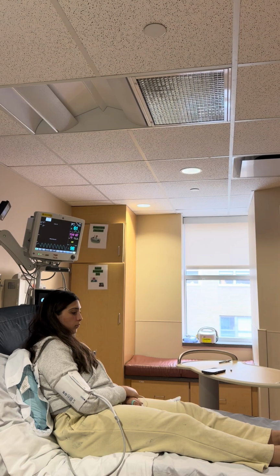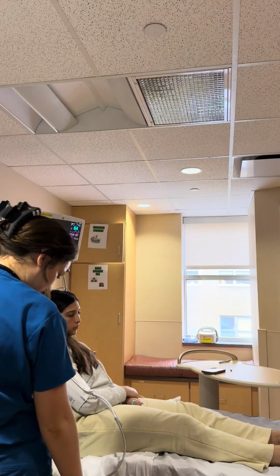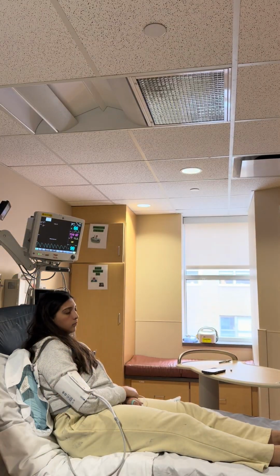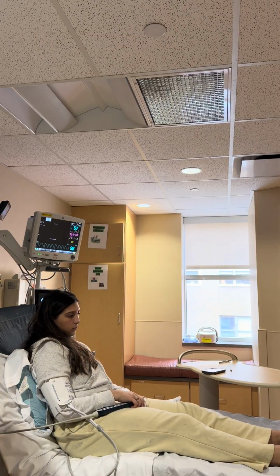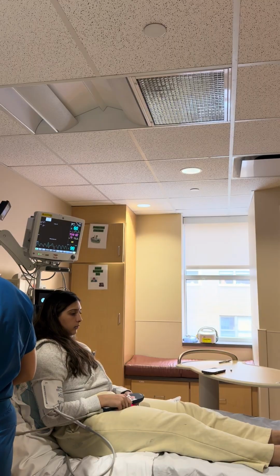I'm going to ensure the bed position is in the lowest position and that the bed is locked, which it is. I will ensure that the call light is within reach to the patient. And then I will raise the side rails as appropriate. So the bed is in the lowest locked position.